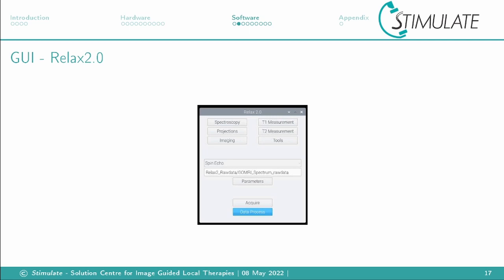I will now show the graphical user interface. The images were captured in February 2022. The look of the graphical user interface might have changed due to the rapid development of the software. The Relax 2 graphical user interface I programmed in the last month is based on Relax by David Schote.